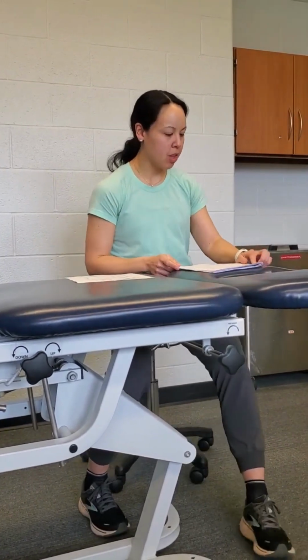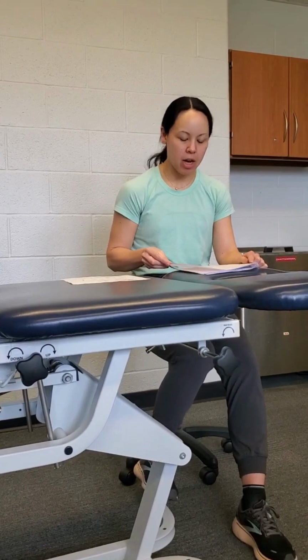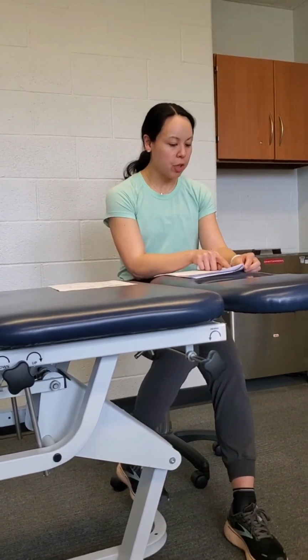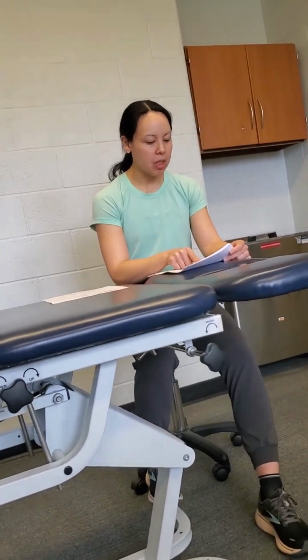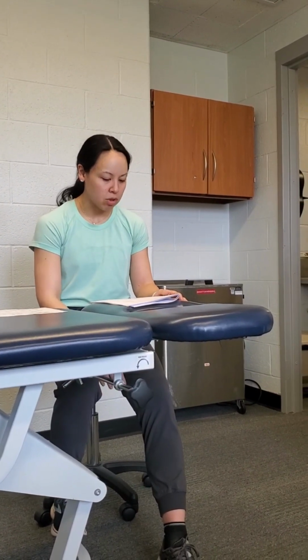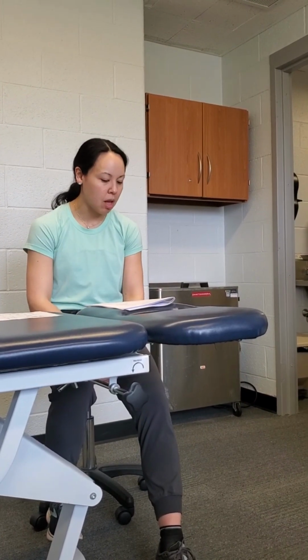Okay, so there are 3 different types that we're gonna be using the BFR for. The first one is passive, and that's really talking about early stage, those post-op patients who are coming in within the first week of their surgery. Maybe more for pain modulation, they can't really do much, they're not comfortable, and you're just gonna put them on the machine, they're gonna lie there and do nothing. So that's passive. They're really not doing any type of exercise with it, or they could be doing some quad sets or ankle pumps and things like that that are really tolerable for them.